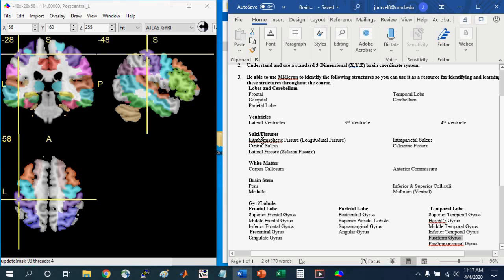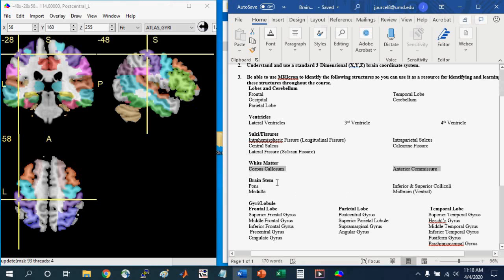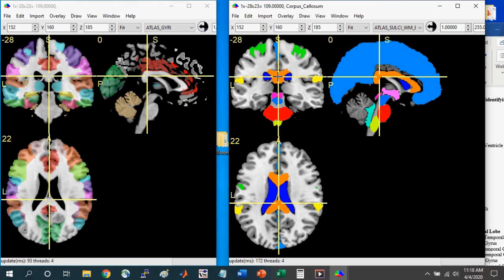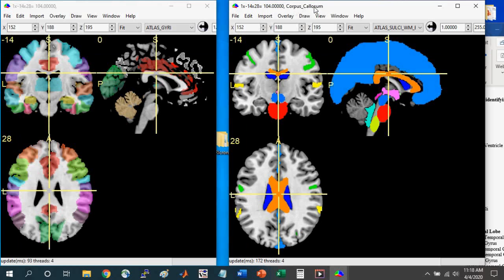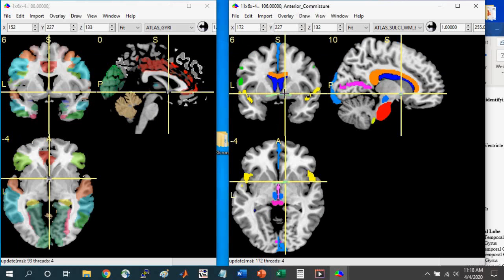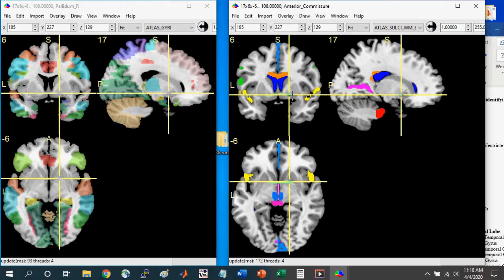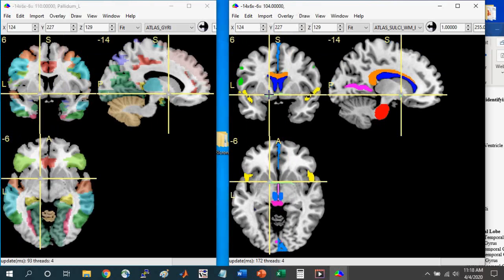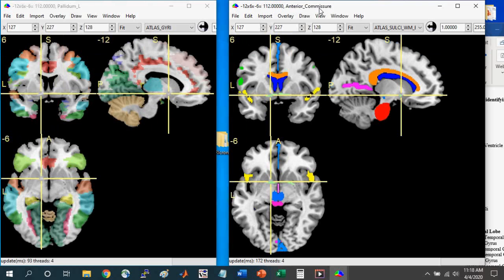So going back to our list of structures, you can identify all of these structures that are listed in the three atlases that I went over. So for further example, we can see the white matter structures here, the corpus callosum and the anterior commissure. So if we go back to the sulci white matter brainstem atlas, we can select different colors and get the brain regions associated with it. And so here in orange is the corpus callosum. And down here in green, this line that spans the hemispheres is the anterior commissure. And so one way to learn these structures is to select a given color, identify the brain region, study it, and then try to quiz yourself later by covering up this name here and trying to identify the brain structures just from memory.